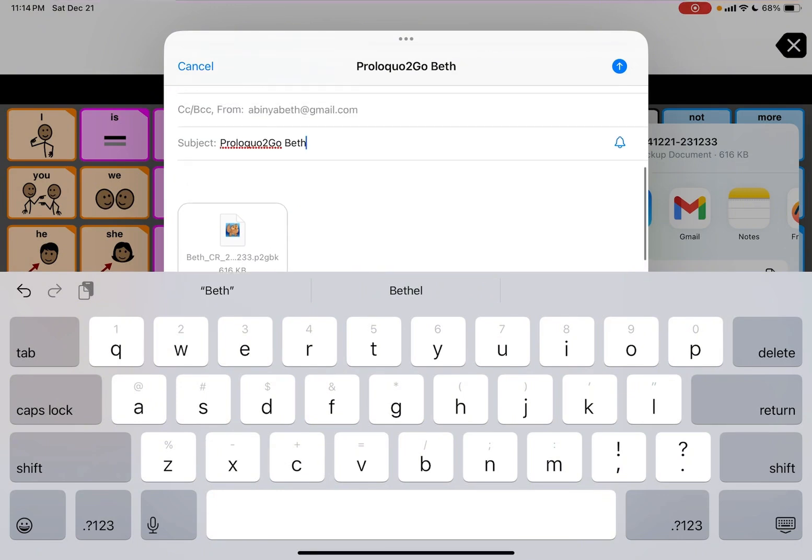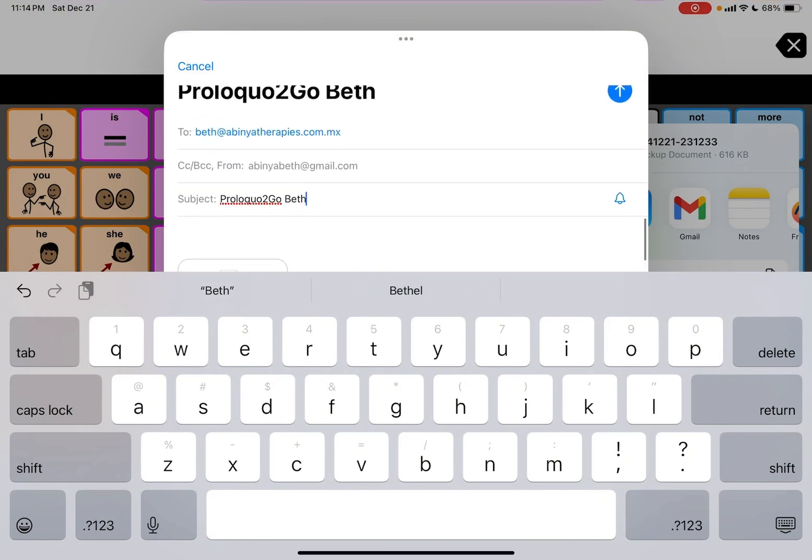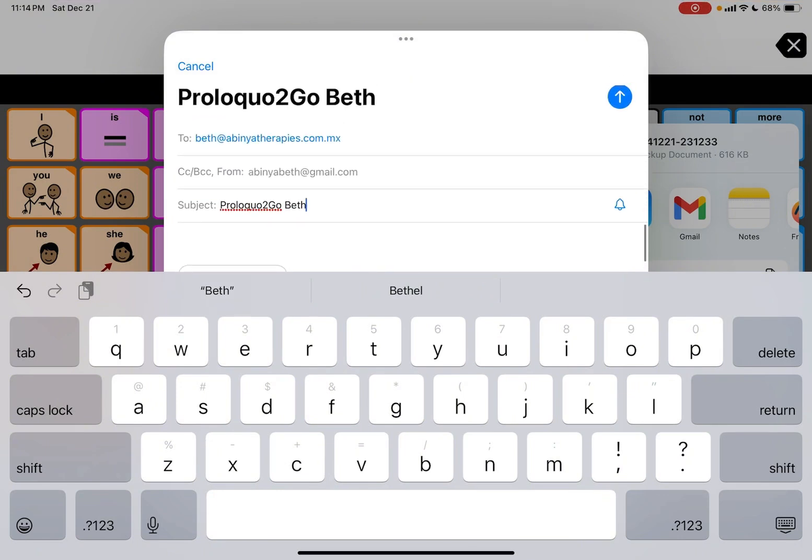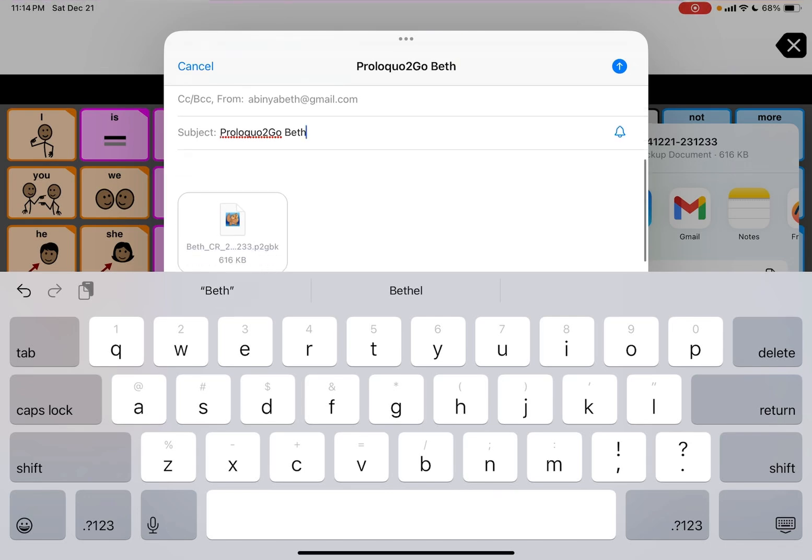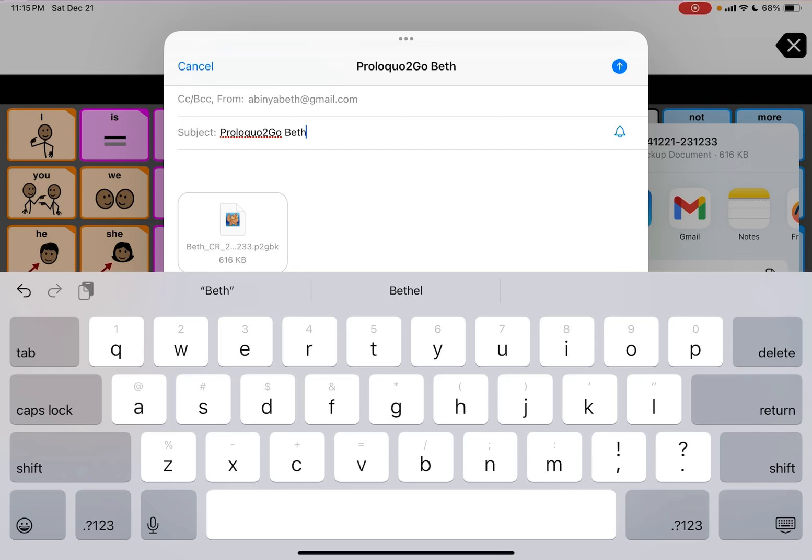I'm going to email it, but just remember that in order for the person to get the file and it looks like Proloquo2Go and it's supported, the device has to have the Proloquo2Go app downloaded on it.